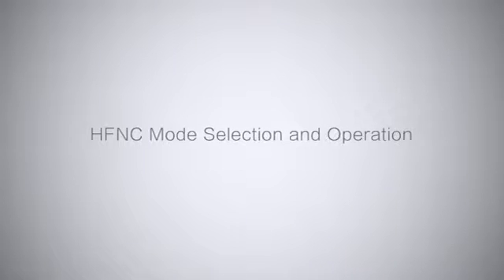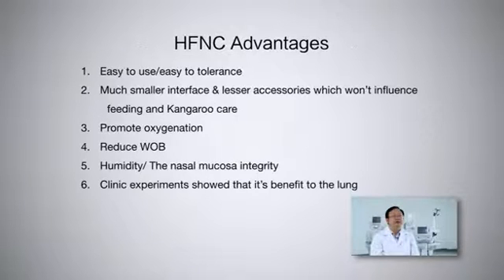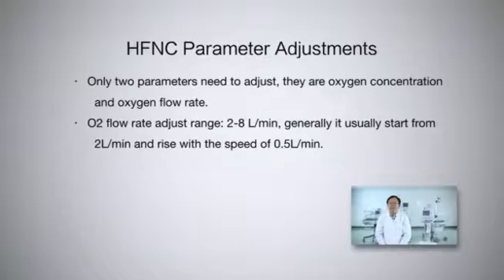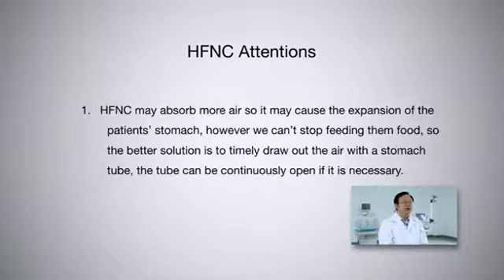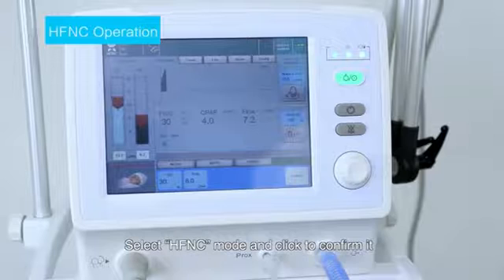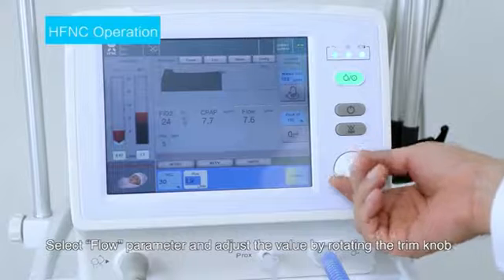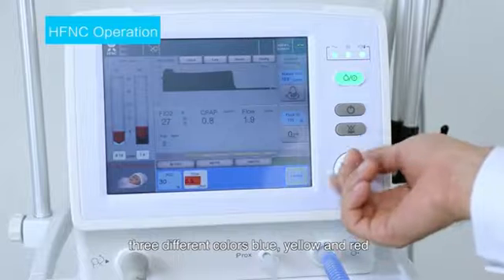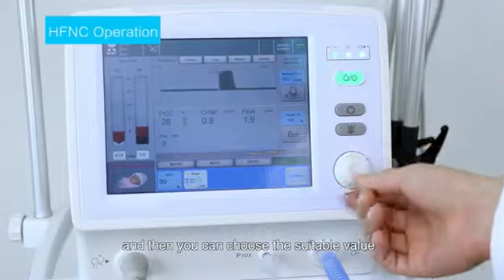HFNC mode selection and operation. Select HFNC mode and click to confirm it, and then the mode will be activated. Select flow parameter and adjust the value by rotating the trim knob. 3 different colors, blue, yellow, and red, indicate different flow value, and then you can choose the suitable value.